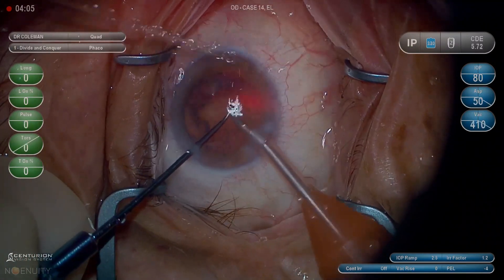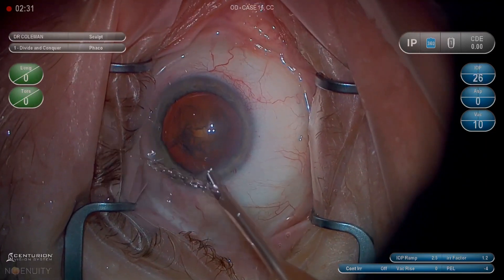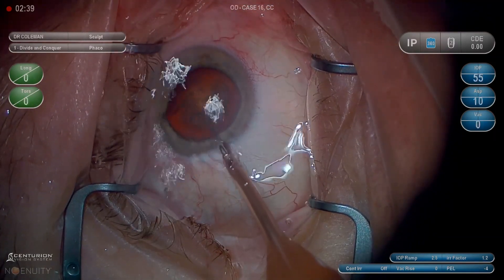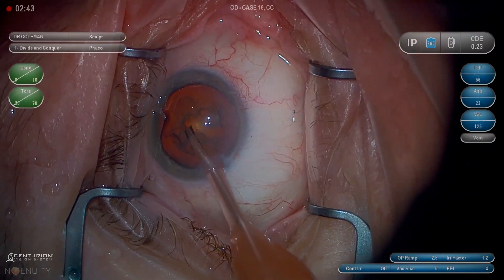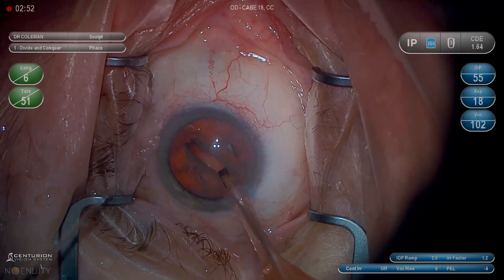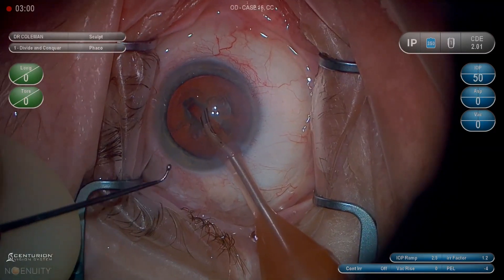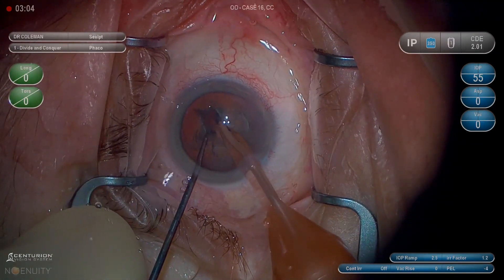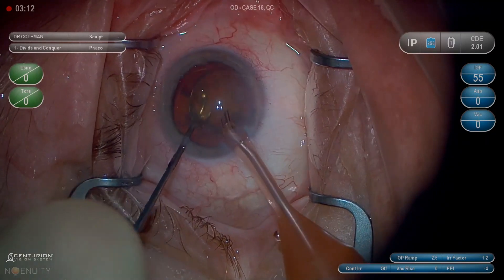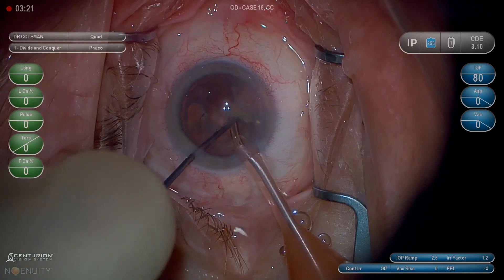When you've still got a piece of nucleus in the capsule bag, that's giving you relative protection against accidentally rupturing the capsule — it can't come forward if it has something protecting it. That protection goes down proportional to how much nucleus you've removed. With three quarters still in the bag, it's really hard for the capsule to come forward even if the chamber goes flat. With only a hemi-nucleus in the bag, it's still pretty good protection. But when you get down to the last quarter, you need to be progressively more careful.